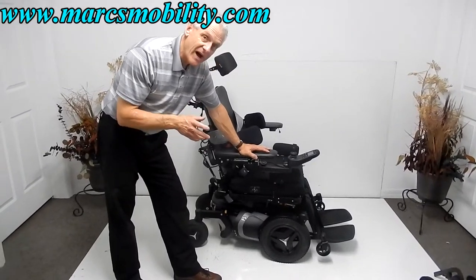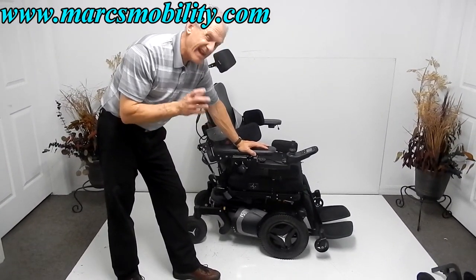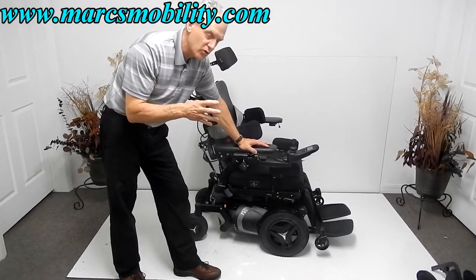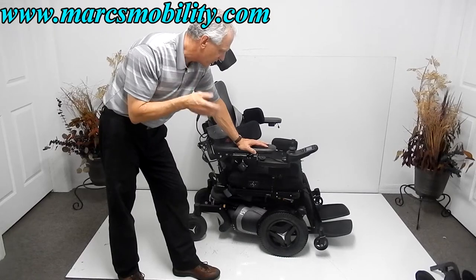This is a Permobil F5 VS standing power chair. The VS stands for vertical standing.